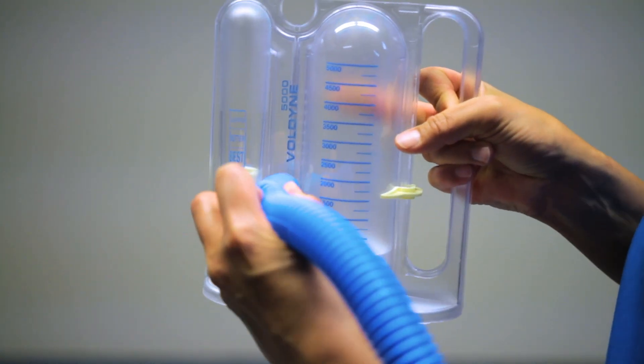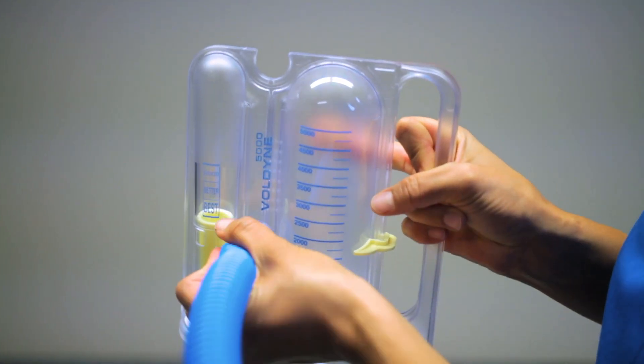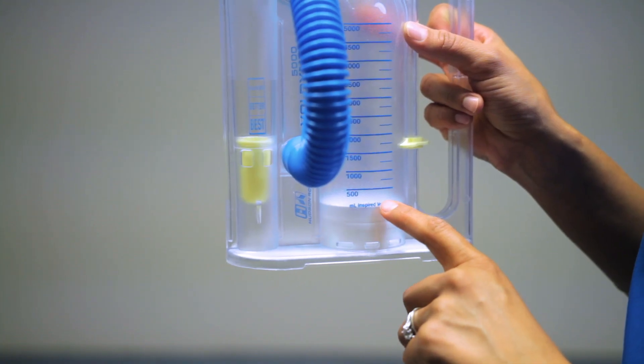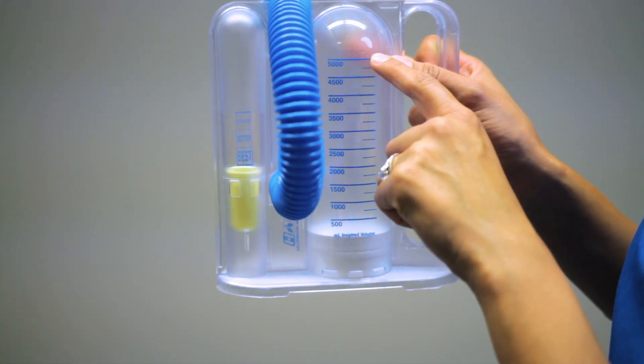When not in use, you want to attach the mouthpiece to the top groove to prevent it from getting contaminated. The cylinder has a piston at the bottom of the IS that will move up and is labeled by milliliters (mL), which is inspired volume beginning with 500 mL to 5,000 mL.